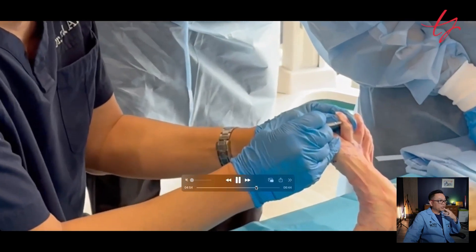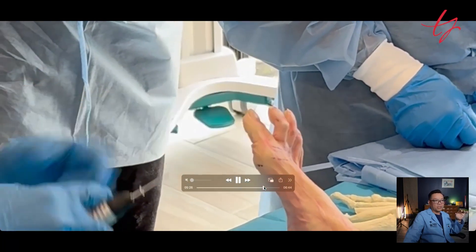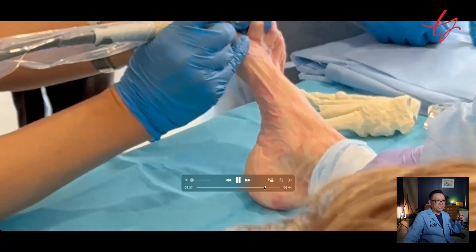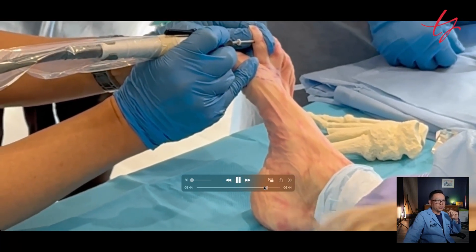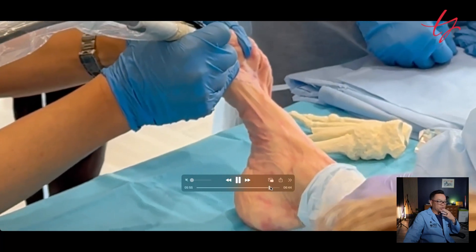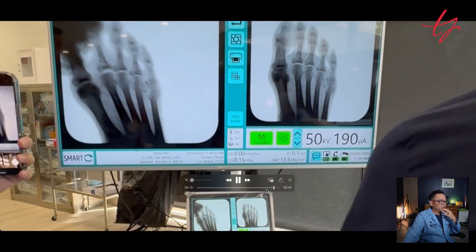Now I'm demonstrating the middle phalanx osteotomy. Make an incision, create a portal, and rasp right there so there's no soft tissue in the way — that's the most important thing. You want to sneak in under the soft tissue and then make a surgical fracture, essentially an osteotomy. The location we choose is a very stable area that doesn't require fixation. The second toe is now done — proximal phalanx and middle phalanx — and you can see both osteotomy sites here.